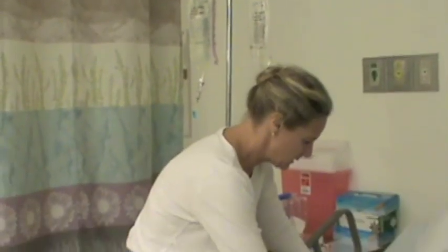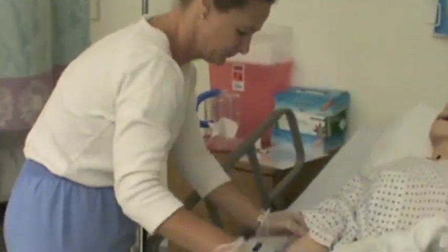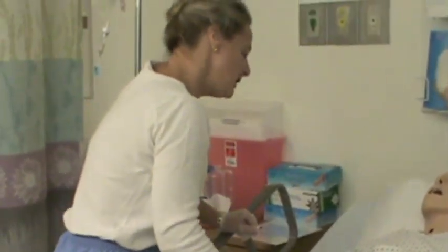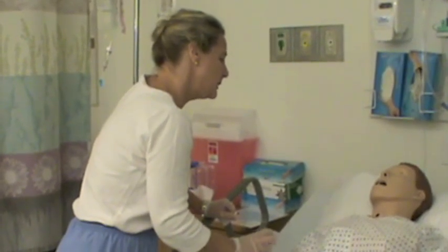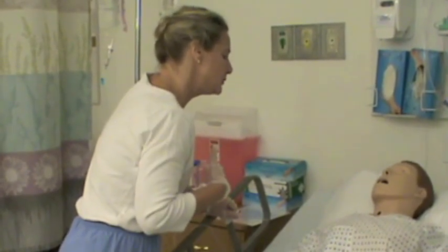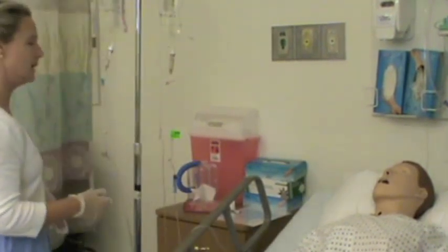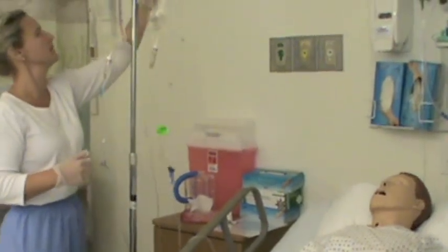I'm just going to tape that a little bit so it's not in your way. Mr. Ito, I'd like you to call me if it's bothering you, if it feels swollen, if it becomes disconnected or you feel wet, or if you have any shortness of breath or anything else. Do you have any questions? No? Okay. You're doing really well. I'll get my garbage out of your way. Can I do anything else for you while I'm here?